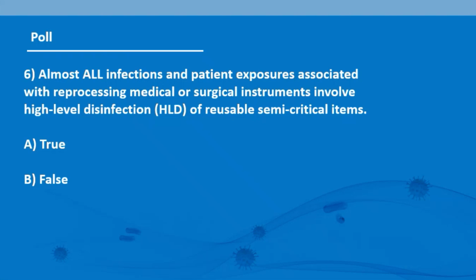Another poll question. Almost all infections and patient exposures associated with reprocessing medical or surgical instruments involve high-level disinfection of reusable semi-critical instruments. And the answer is true, and that is according to researcher William A. Rutala.